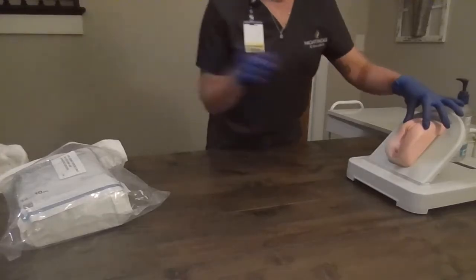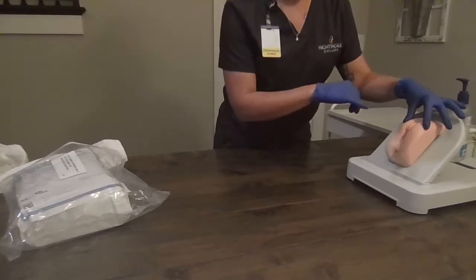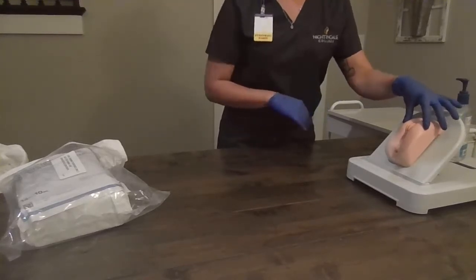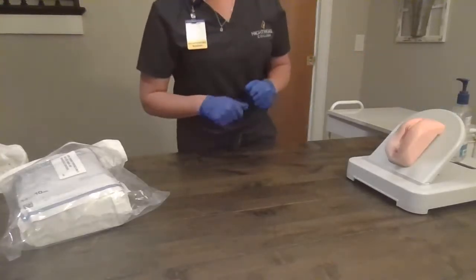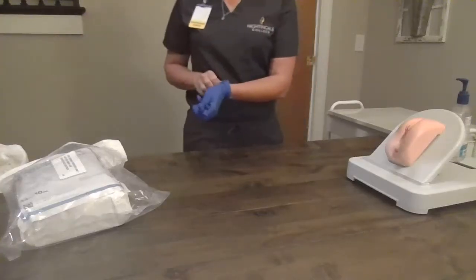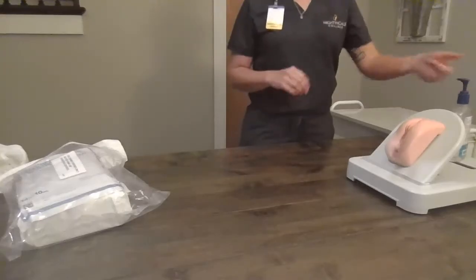I'm going to check her anatomy, look for her urinary meatus, see if I can see that opening. I'm going to also assess for any discharge, discoloration, or malodorous smells. Ms. Smith, we are going to insert the Foley. Discard my gloves and perform hand hygiene.